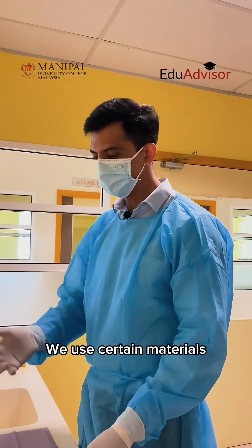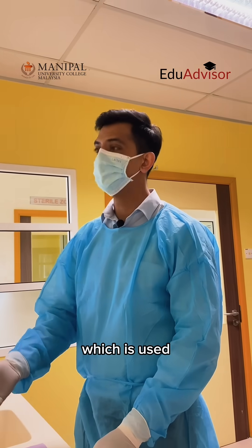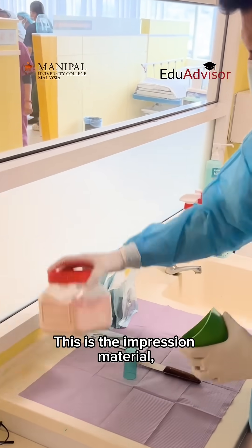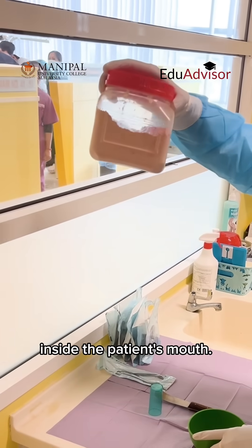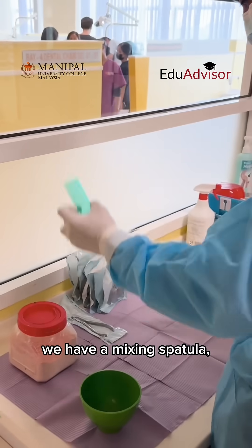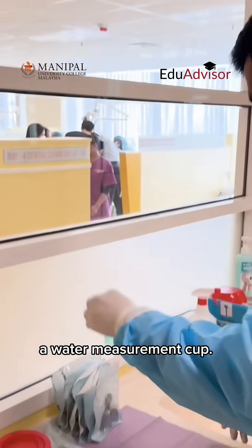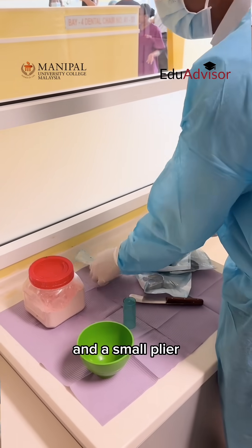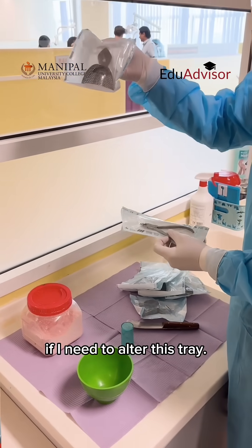We use certain materials to mix the material which is used to make the impression. So this is a rubber ball. This is the impression material which will be placed inside the patient's mouth. And then we have a mixing spatula, a water measurement cup. Then we have two trays which are used to make the impressions, and a small plier if I need to alter this tray.